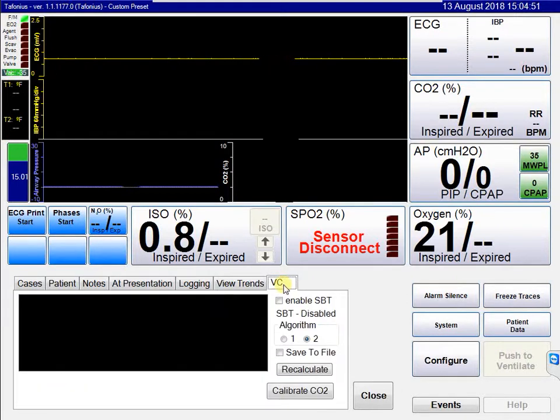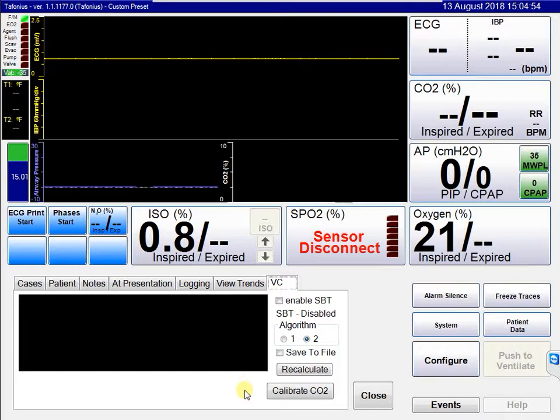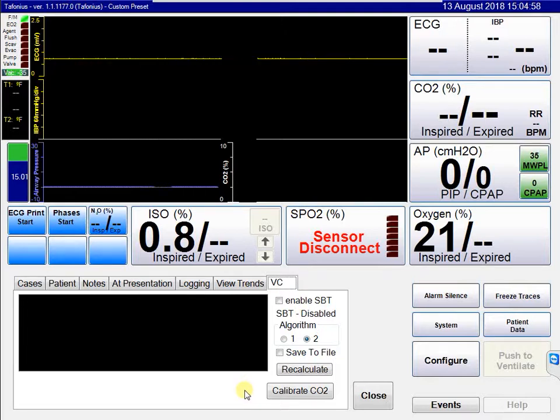The VC tab is not enabled in many machines, as this is for volume capnography which is currently in the trial stage of development.